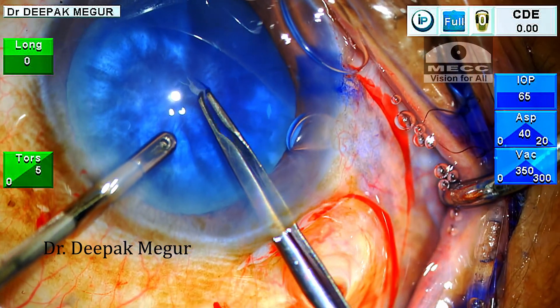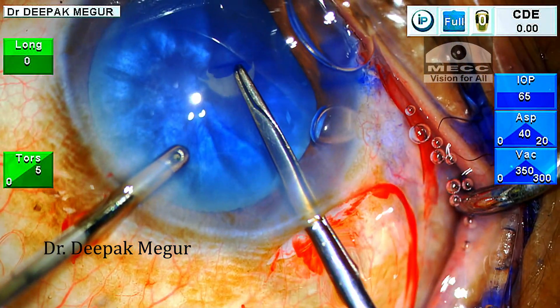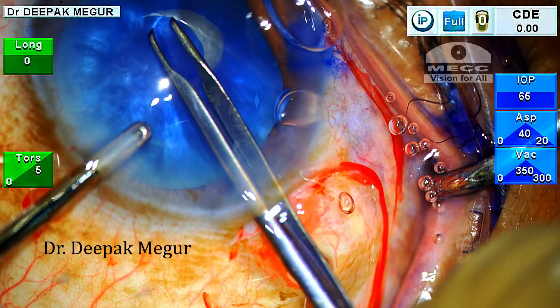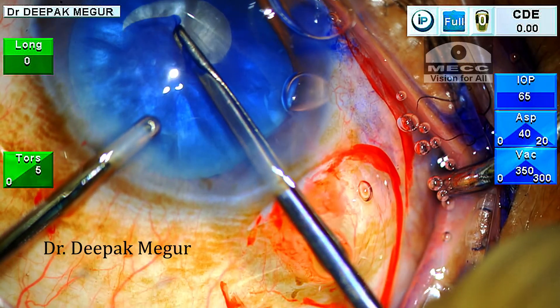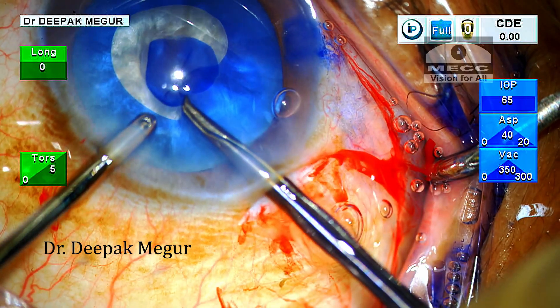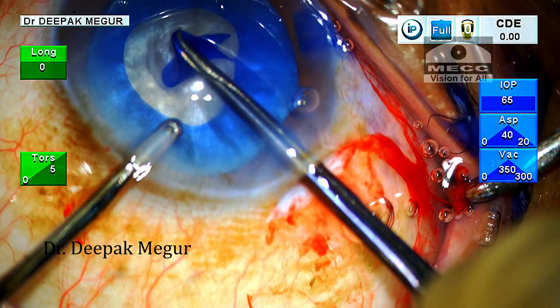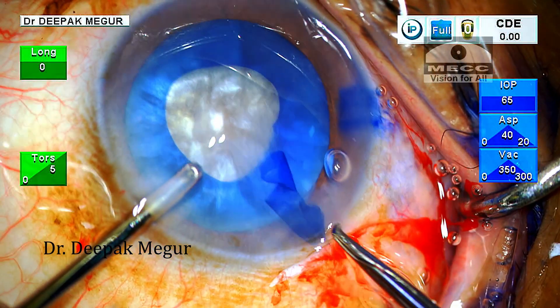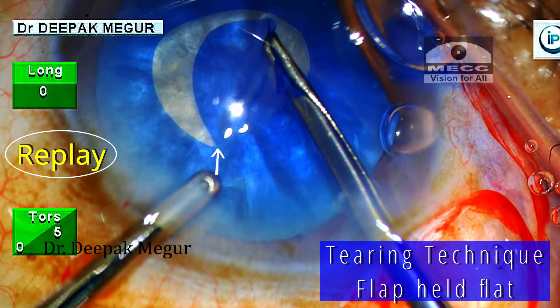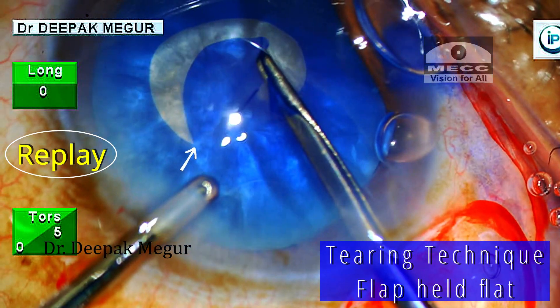The capsule is punctured gently and then the rhexis is initiated with the forceps. At the moment, I am using the tearing technique. Carefully have a look at the flap which is being held flat and then being torn — this will help me create a smaller initial rhexis. Although the tearing is not as well controlled as the typical shearing technique, I find this tearing technique ideal for creating the small primary rhexis in these swollen lenses, as it minimizes the chances of the rhexis running away.